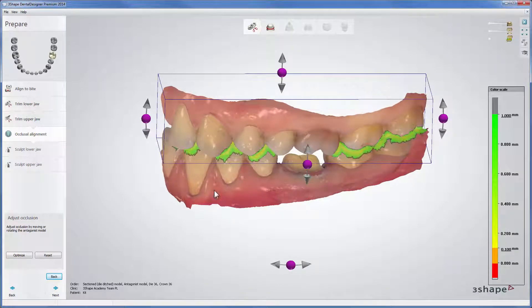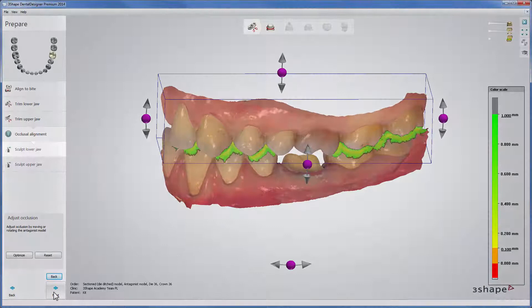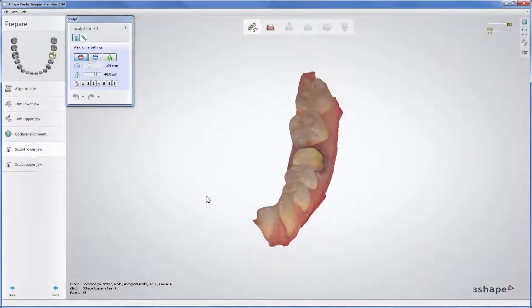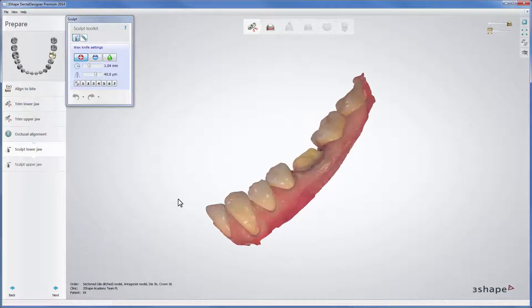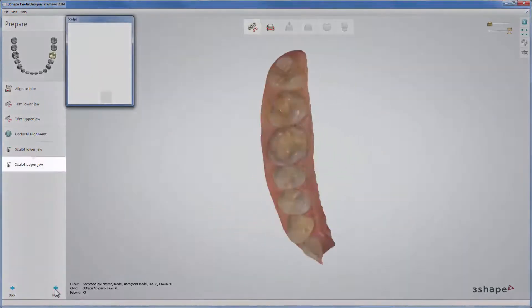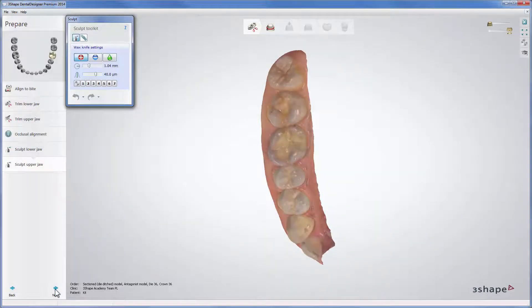Pressing Next takes you to the optional steps Sculpt Lower Jaw and later on Sculpt Upper Jaw, where you can use the Sculpt Toolkit to modify scans. Once finished, click Next to proceed to setting the margin line.